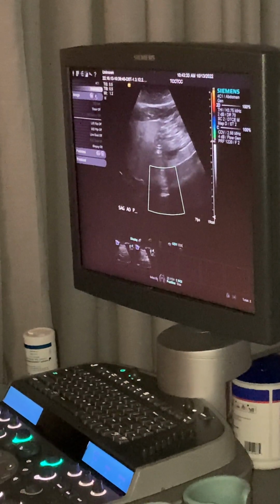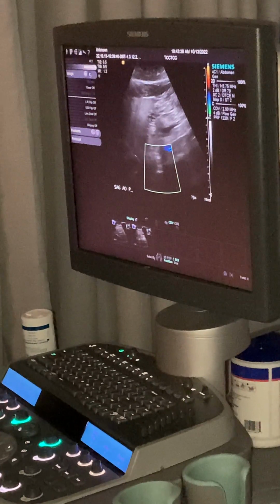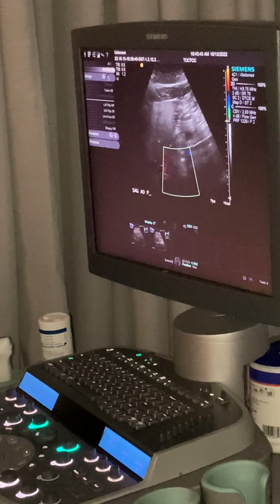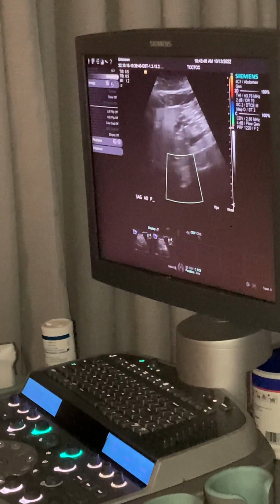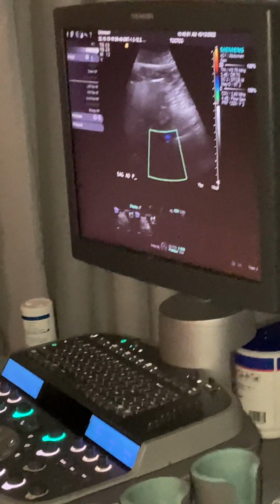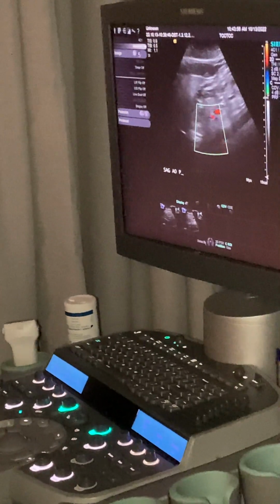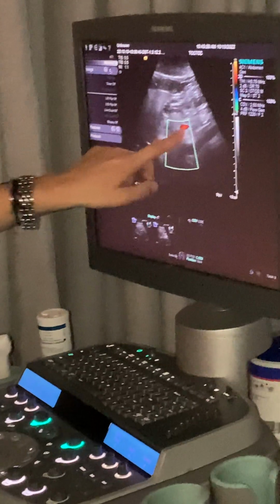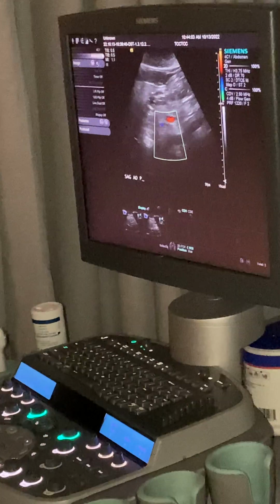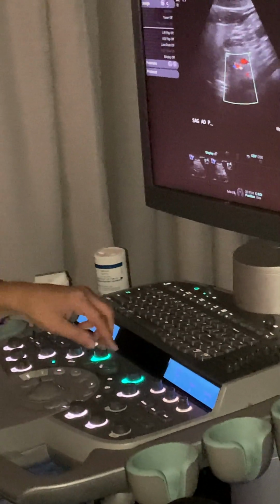It's like if I'm looking through a little tiny tube, I'm still seeing the same thing as if I'm looking out at bigger things. It doesn't change it. If we can't see it, should we touch the settings? Should we go from 19 to 17? Yeah, we can try that, but honestly, I know it's the machine. We had this problem with the other lab. It's picking up flow at our portal splenic confluence, it's just not picking up anywhere else. I don't know why. It's just the way the machine works. Pretend we got a color image, okay? And we'll try for one here on the mids and stuff.